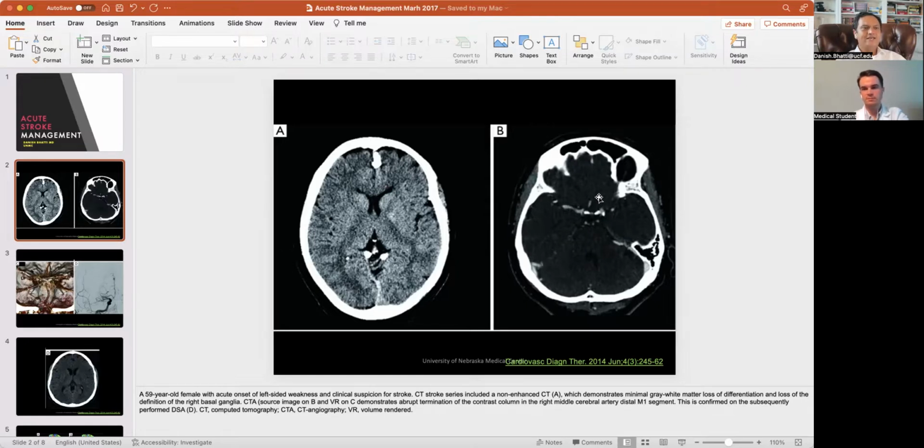And you can see that they have removed the negative part of the Hounsfield unit, let's say below 0. And what it has done is that the brain has started to disappear. But now you can see more details in the skull. So you can start seeing these air pockets, which were not very visible before. But it has also highlighted the blood vessels. So you can see that there is a blood vessel on here and there's a blood vessel on this side.